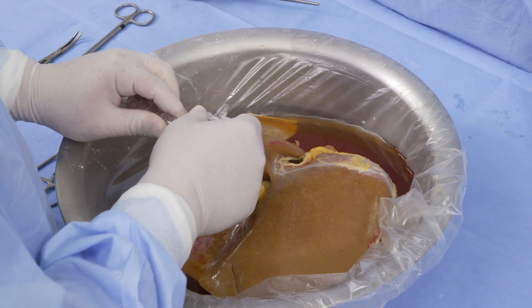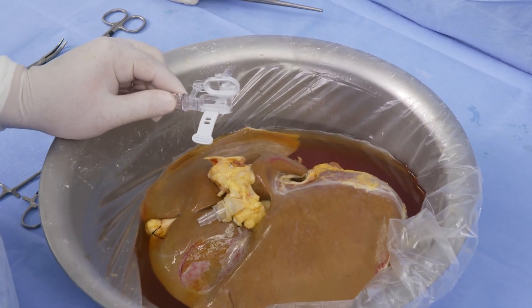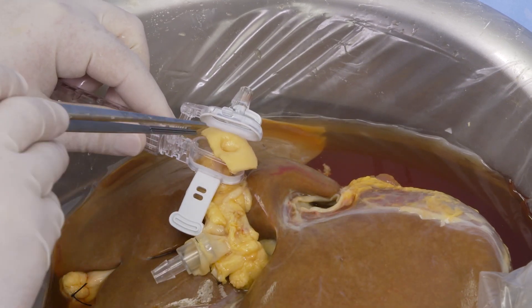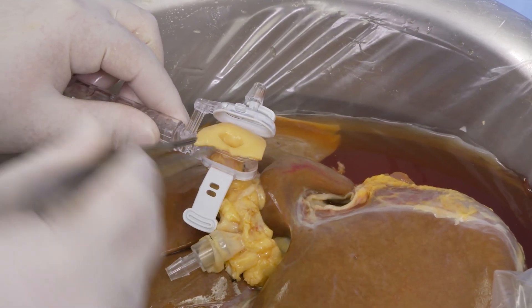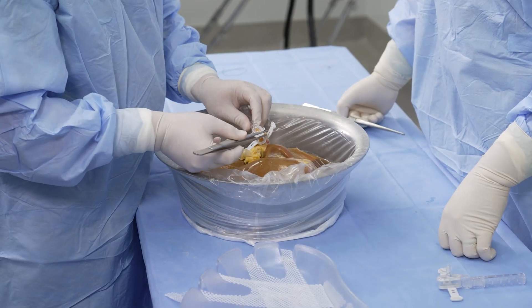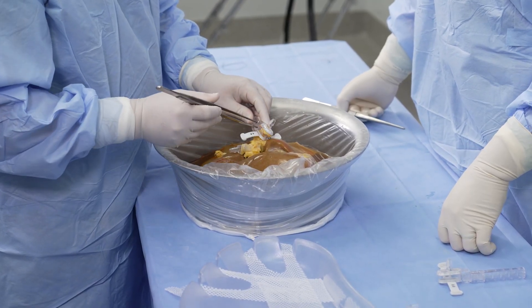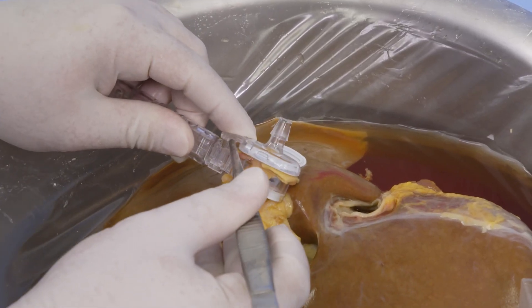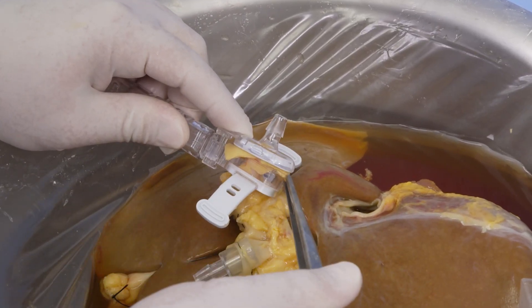Unhook the straps and open the cannula. Slide the aortic patch through the center of the cannula ring. Lay the patch flat so that the tissue covers the entire cannula ring. The upper half is rotatable and can be moved out of the way to facilitate proper placement of the patch. Instruments such as forceps can also be used to temporarily hold the tissue in place until the cannula is secure.